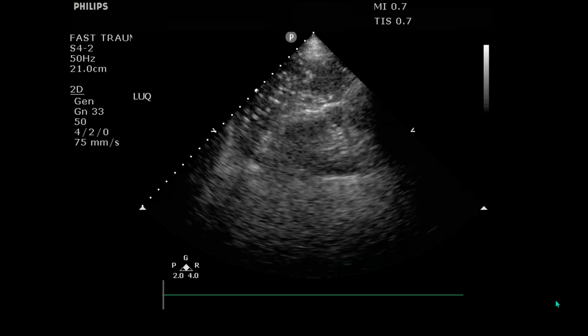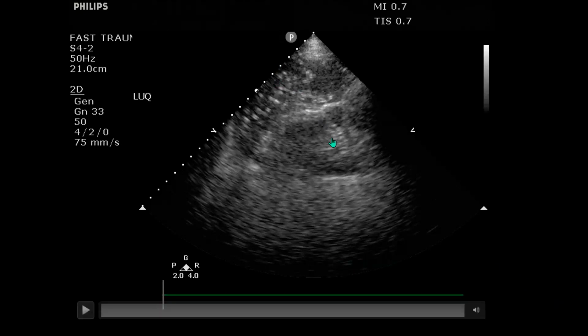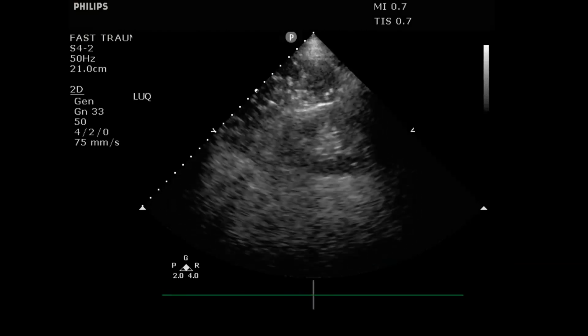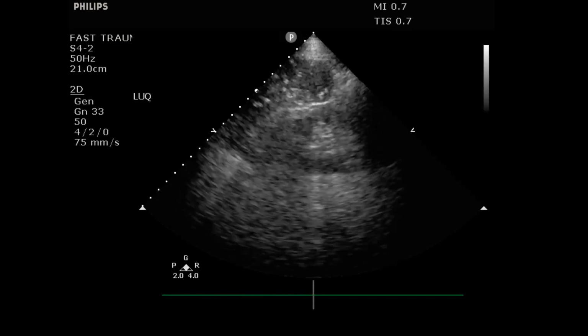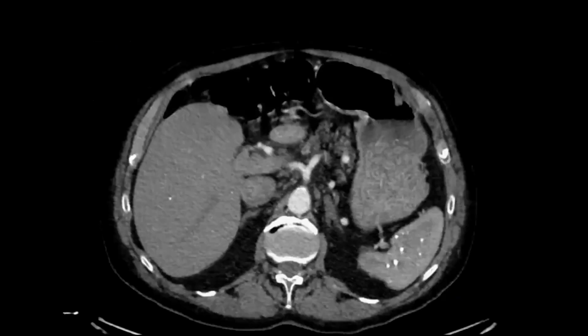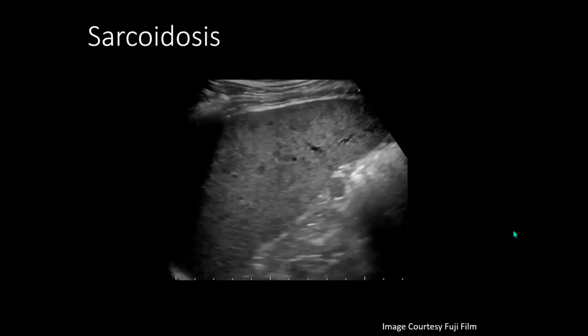And then this is a patient that we were doing a FAST on. And you can see the spleen and you can see the kidney. And as you're going through, you're like, wow, it's like Starry Night in the spleen. Cool. So those are examples of granulomas. And it turns out that this gentleman had actually lived in New Mexico and had histoplasmosis. So you can actually see that there's a couple of these granulomas in the liver as well.